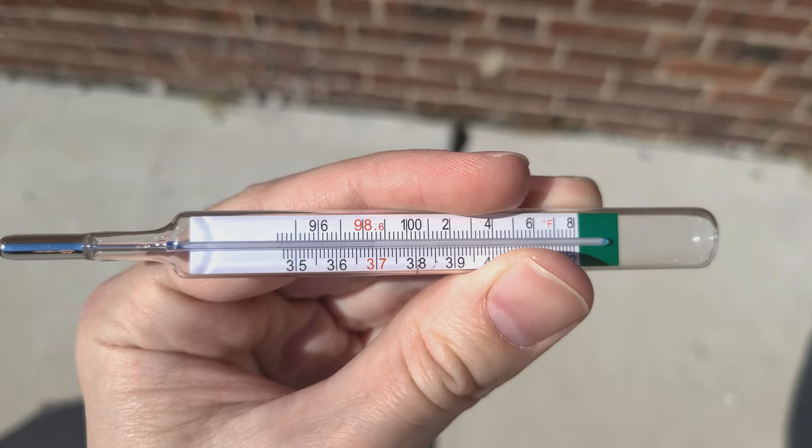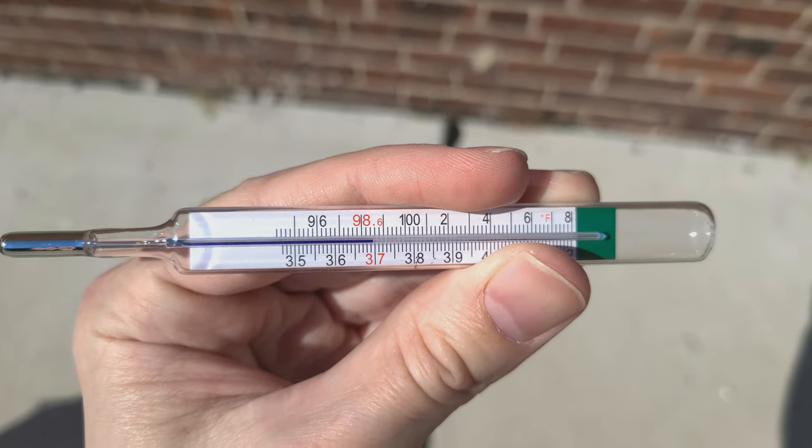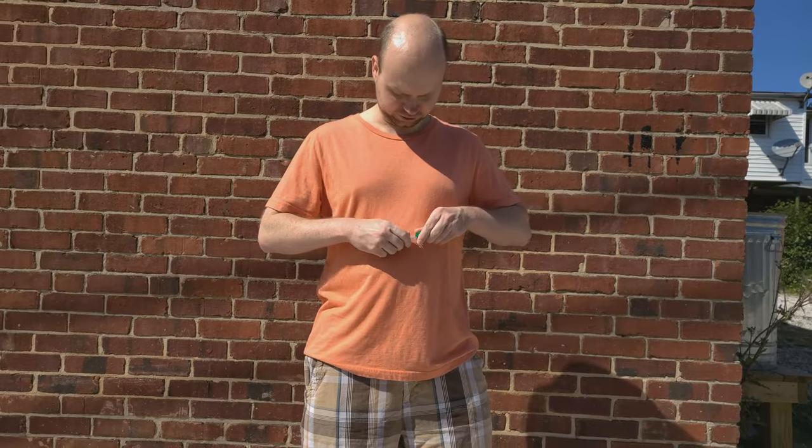So in this video I'm going to show you something I call the thermometer trick. It's really hard for some reason to reset these things with a wrist flick. That's what they tell you to do — use a wrist flick. I don't know what that means, okay?